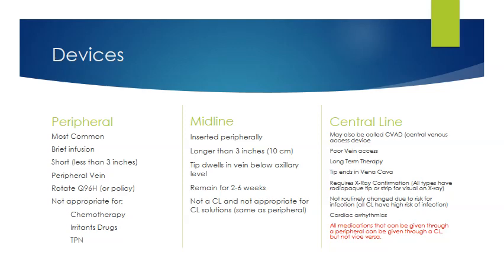So I hope that you paused it and came back, and I hope that your thought process went to this: a central line ends where? It ends in the vena cava, right above your right atrium. Sometimes that even slides down into the right atrium. So if I have that line so close to the heart, would it stand to reason that it could cause some interference and cause me to have arrhythmias?